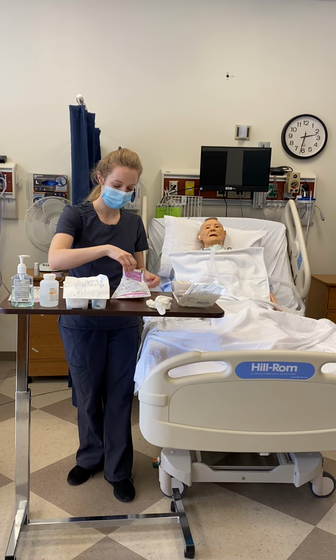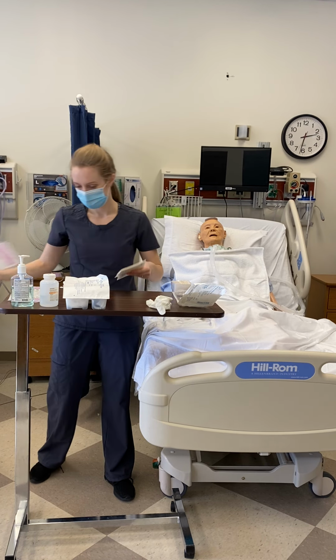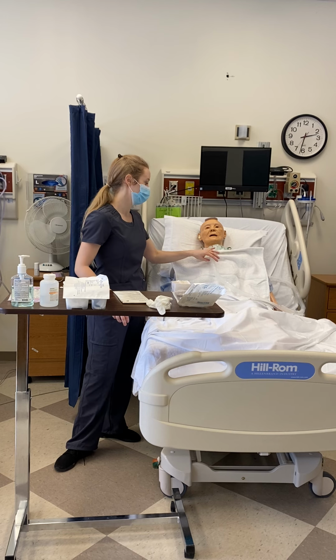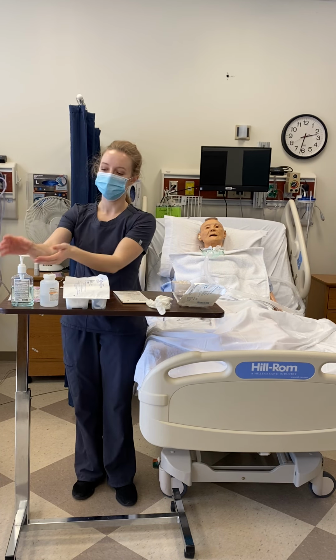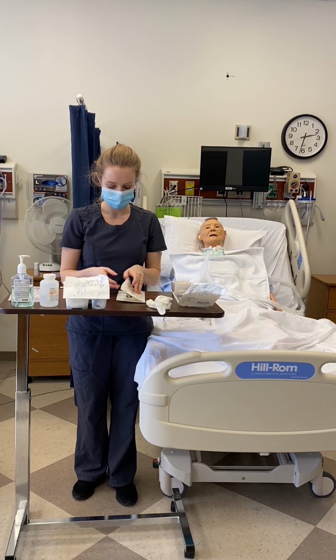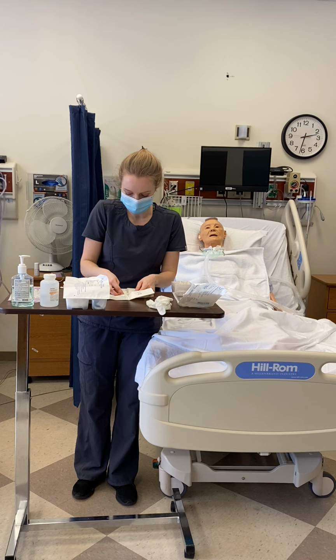Actually, before I put on my sterile gloves, I'm going to remove the oxygen so I don't get my hand dirty early. Now hand hygiene again, since I just touched something. And opening my sterile gloves.